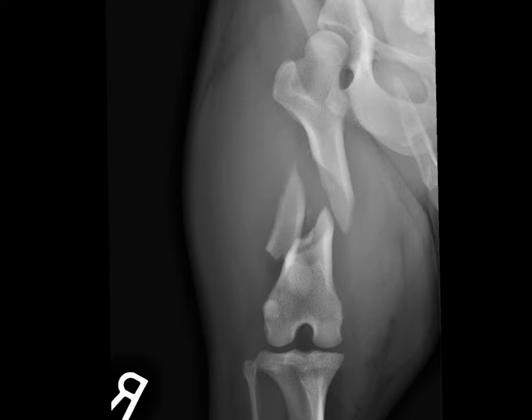So this is a butterfly fragment. It's important to notice that because it often affects how surgeons will approach the fracture. This patient, luckily, was able to have internal fixation.